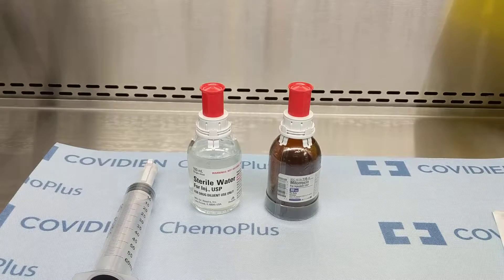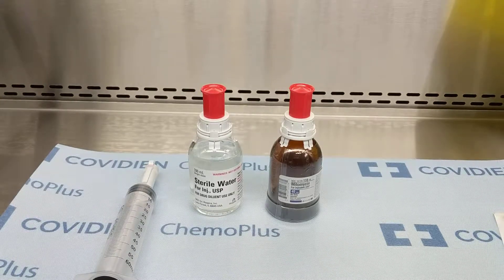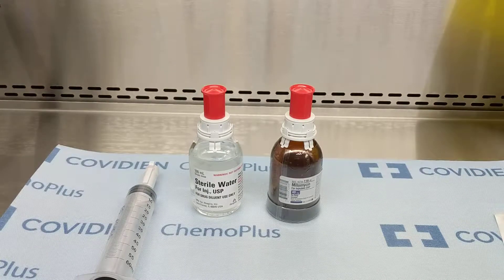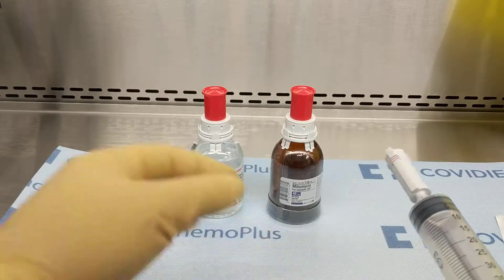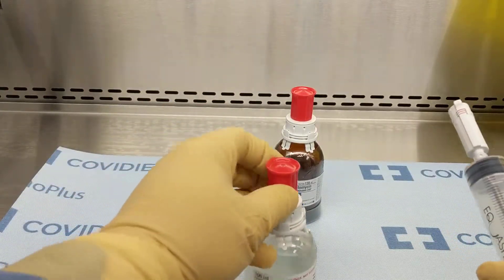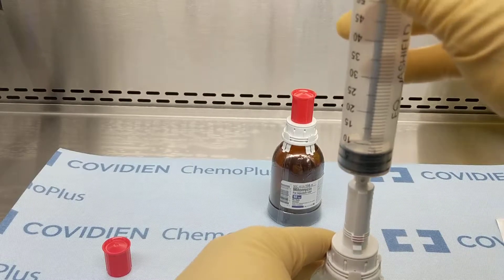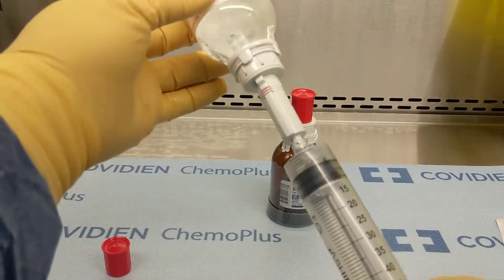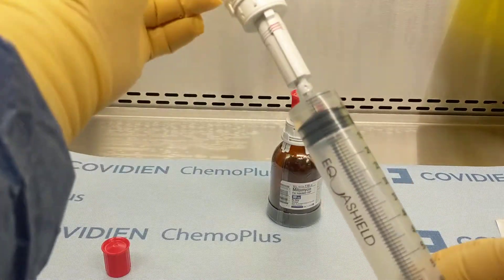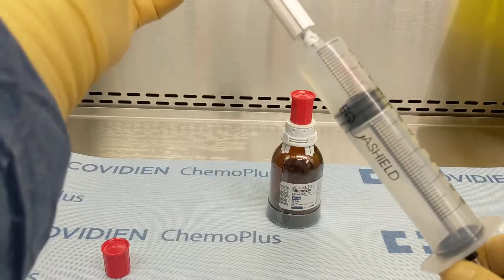I'm preparing mitomycin for use in the OR by urology. After everything is assembled, the first step is going to be to withdraw 40 mils of sterile water from the vial.